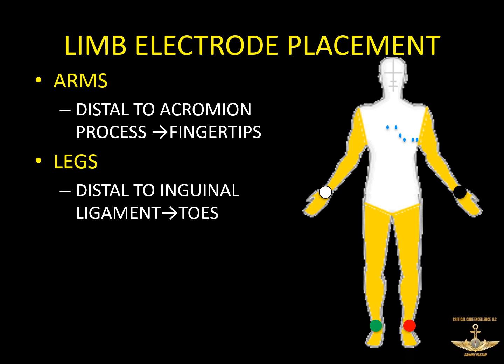If you'll notice, most modern EKG machines, the red and green wire are twice as long as the black and white wire because they are made to go twice as far away. They're made to go all the way down somewhere on the legs.